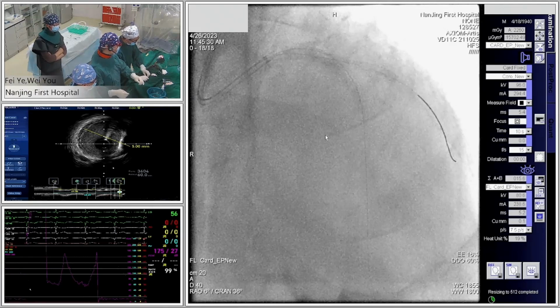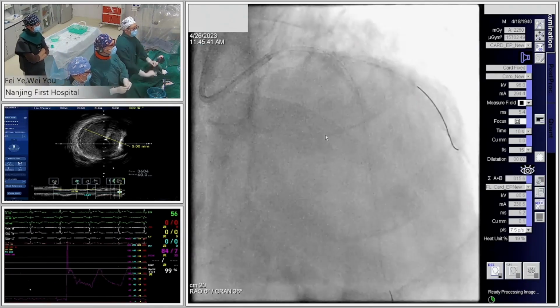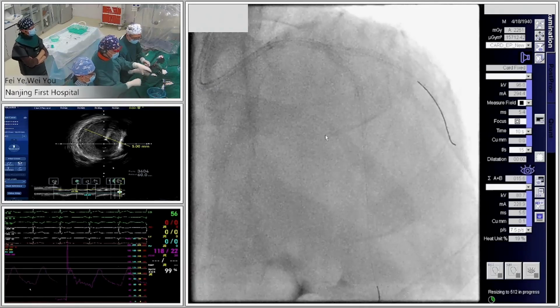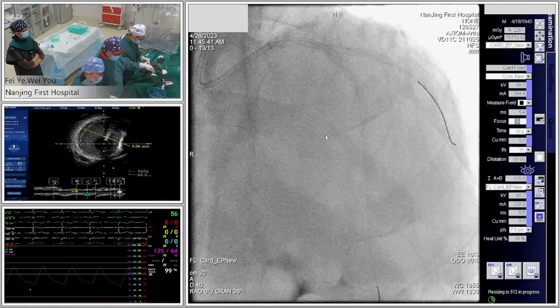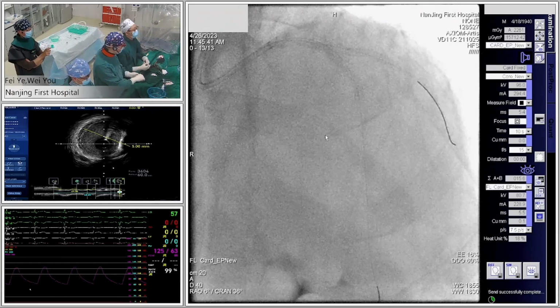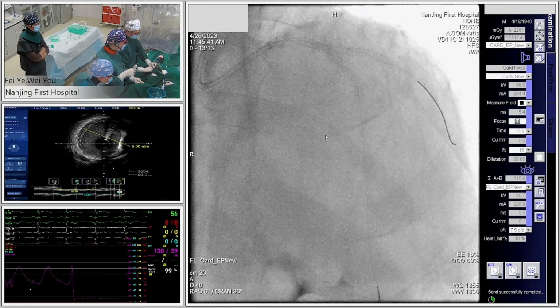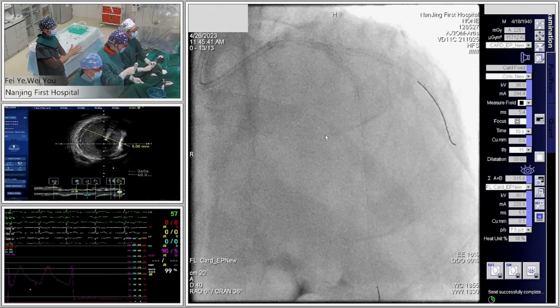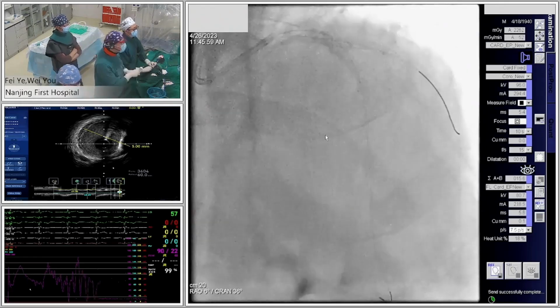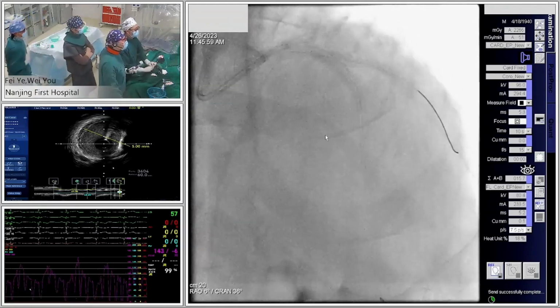And also the 4.0, yes, for the POT balloon. Give me 3.5. Sometimes if we are stenting in a main vessel with a very short length, or not a very long length, in the proximal part of the left main vessel, we like to use a jailed wire tactic. We cannot find any resistance when we pull back the side branch wire.